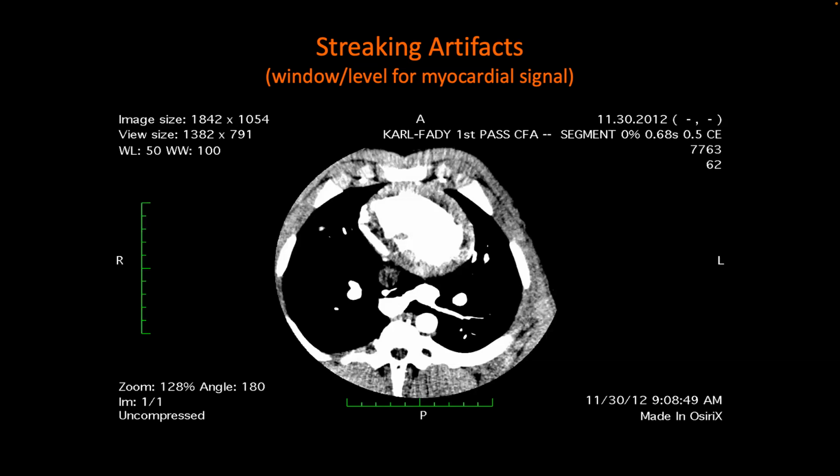But not everybody has access to a PET scanner, right? So it's not commonly done. MR perfusion, fantastic method for perfusion. However, MR scanners are all in radiology departments, and so cardiologists don't send their patients to MR that often. But it turns out that the perfusion itself didn't really predict what was going to happen to that patient.